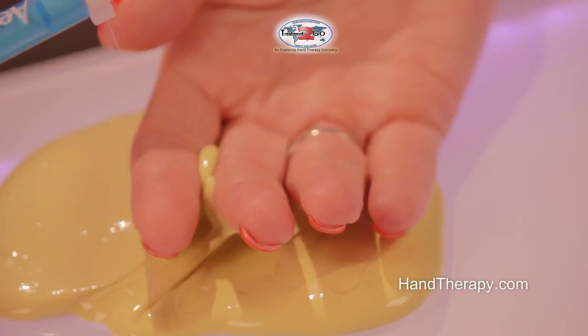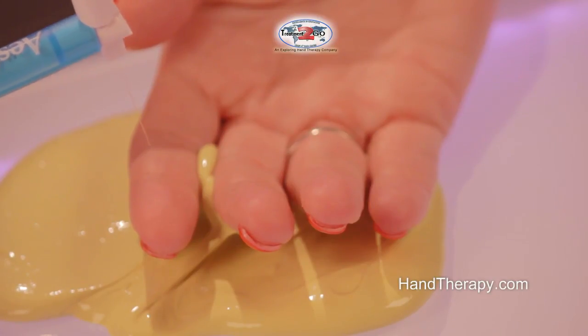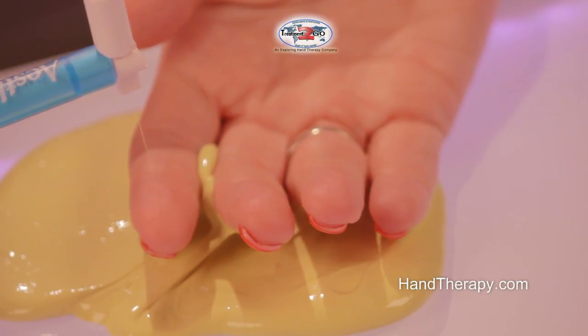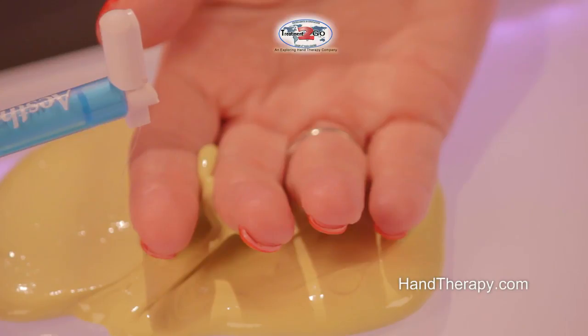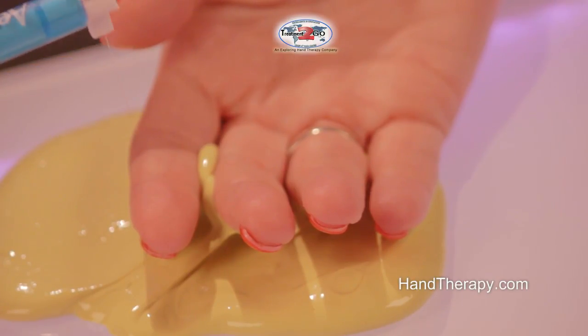We start by stabilizing the patient's hand in putty so they can't move. Then we bring this monofilament down and deform it into a C. We ask the patient if they feel it to say 'touch,' and we do it three times.